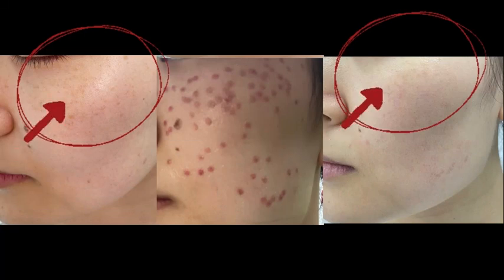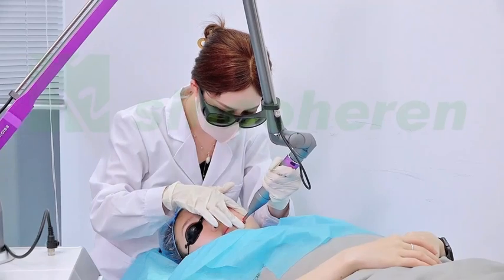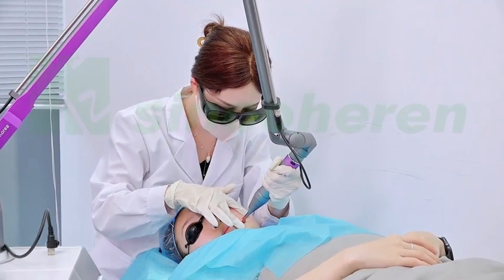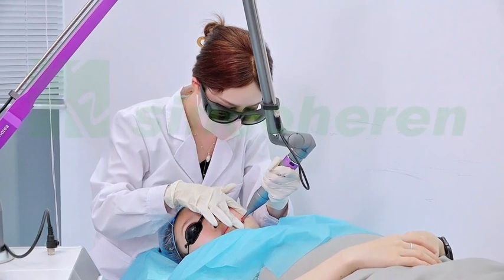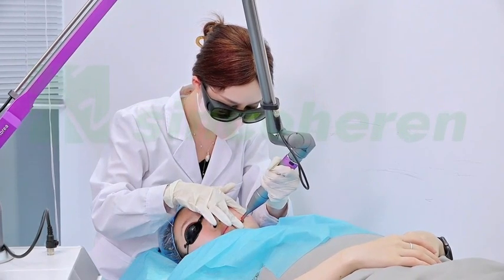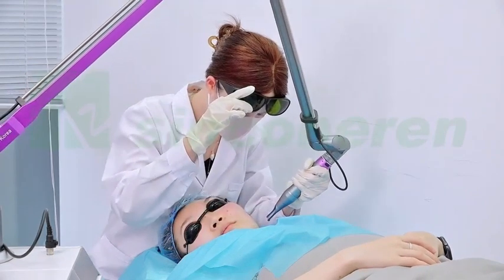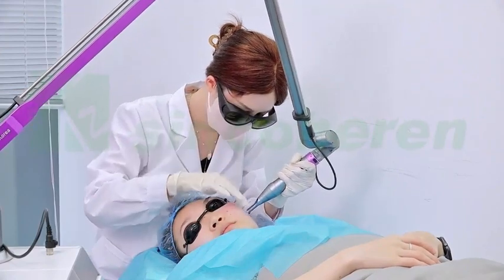For colorful tattoo treatment, after 2 months of recovery, if the color of the tattoo remains colorful, use the last handpiece again to do treatment. If the color turns gray and black, scan with the 1064 nanometer handpiece. Treating the thin skin of parts, such as the forehead, can slightly reduce energy.